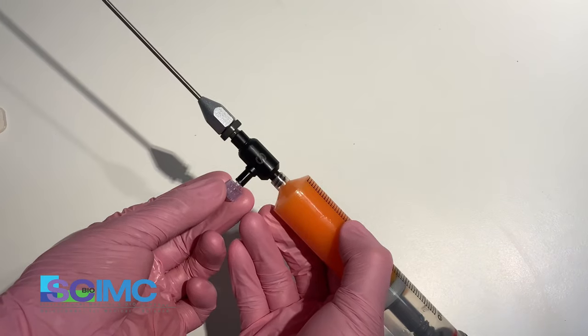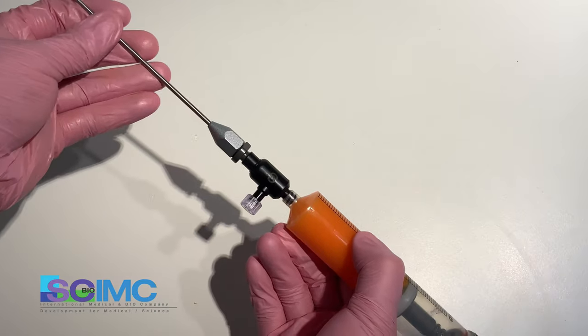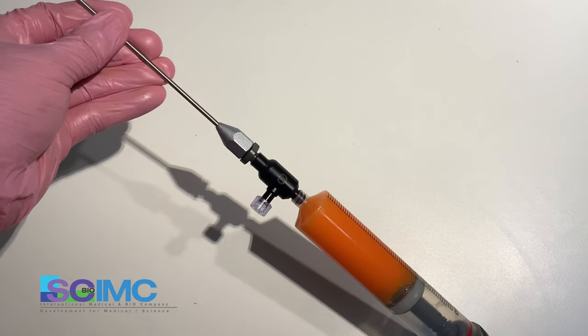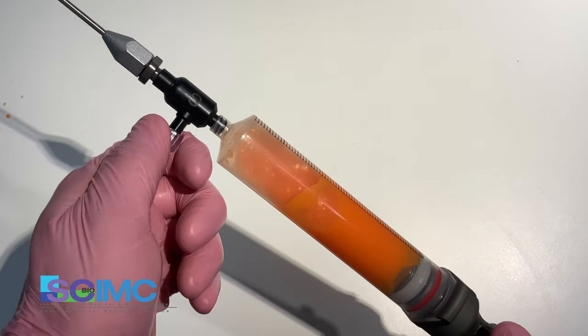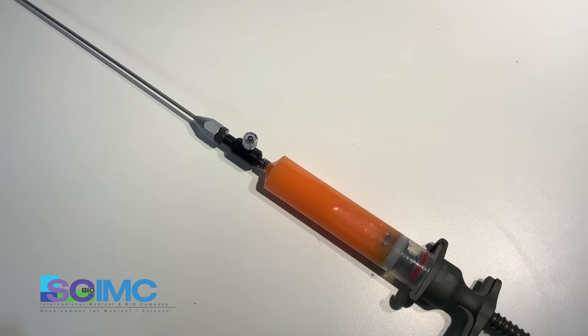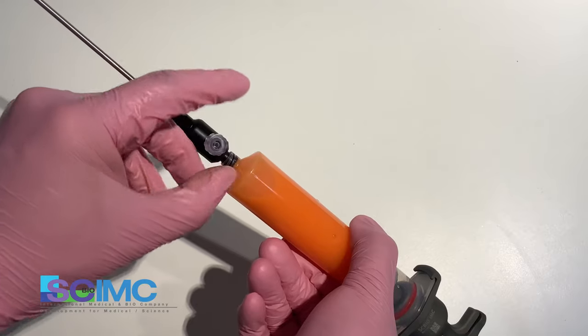This is the protection cap. Protect for the contamination. When you remove the air, open a little bit. When you need to transfer harvested fat to the empty syringe, open the cap.